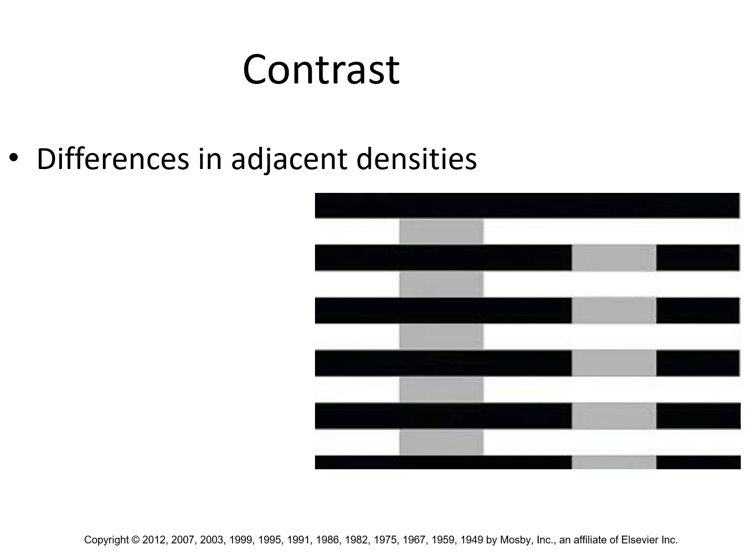All right, contrast. What is contrast? It really is the way we see edges. The whole reason you can see black lines and white lines with gray bricks is because all those things are different colors. And now, which column of gray rectangles is darker? Is it the left gray rectangles or the right gray rectangles?